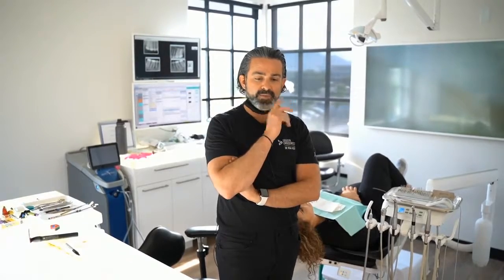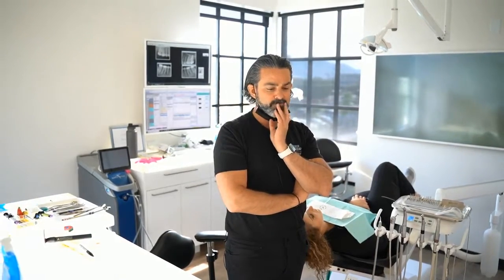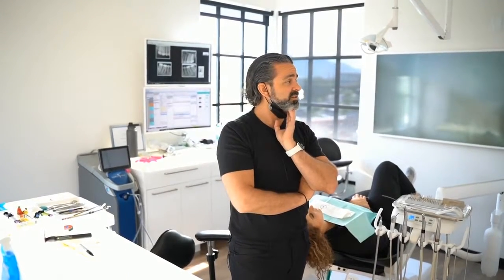I can actually see the details there, and that's phenomenal. I have a prosthodontist down the street who uses one for the exact same reason. If you ask him what his favorite thing about the microscope is, he says it's crown preps. It's very easy to posture that microscope, keep your correction, and see all surfaces, even the distal lingual surface, which is sometimes quite hard to see. So yeah, I think those would be the biggest assets of using it.